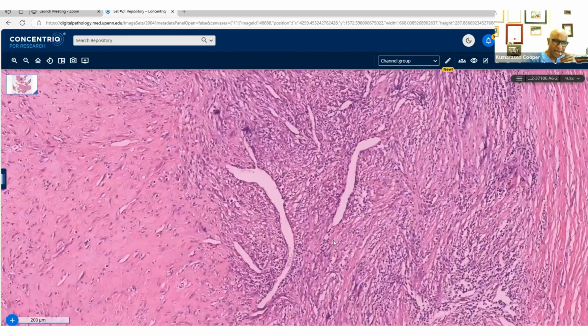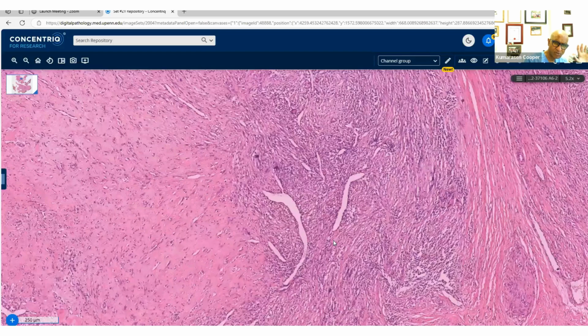And also, just for confirmation, the immunohistochemistry for myopericytoma, or if we use the generic term, perivascular myoid tumors, those are typically actin positive. Some of them do have some genetic abnormalities that have been described, which I'm not going to go into, because you don't really need any genetic confirmation for the perivascular myoid tumors. All you need is some immunohistochemistry, depending on which tumor you're talking about.